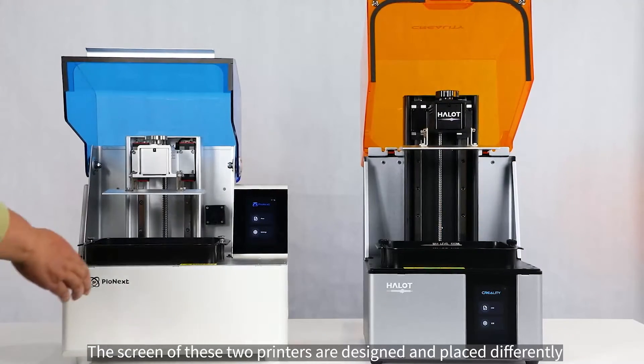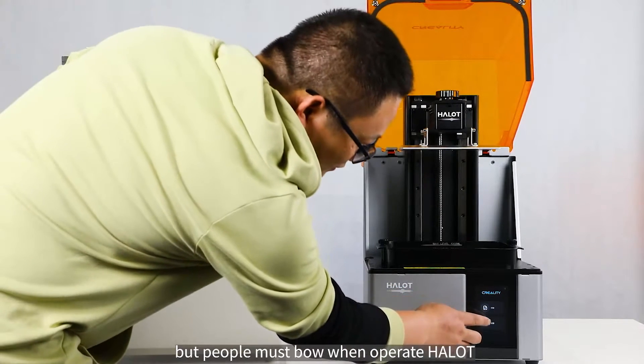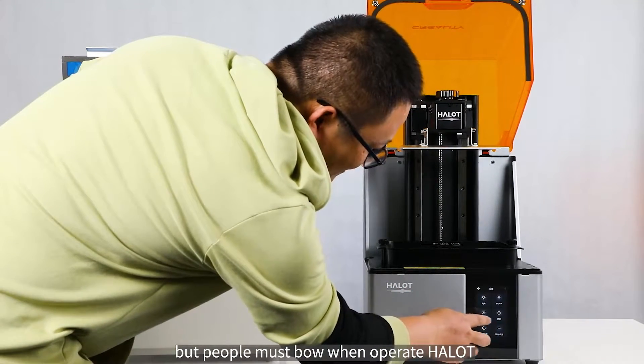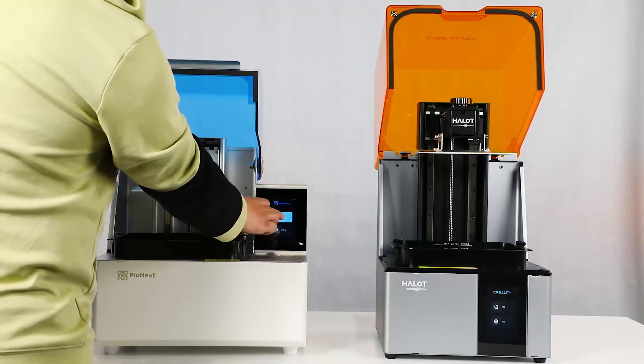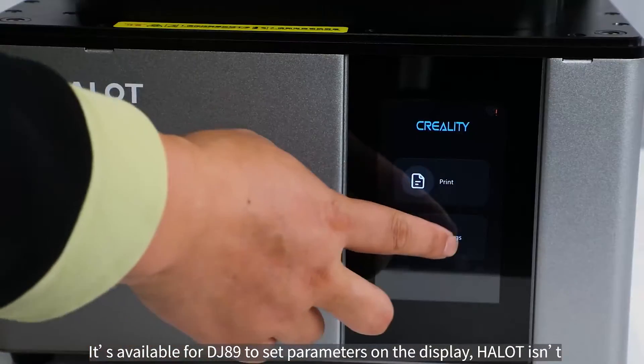The screens of these two printers are designed and placed differently. The DJ-89 is more humanized, but users must bow when operating the HALOT. It's possible to set parameters on the DJ-89's display, but not on the HALOT.